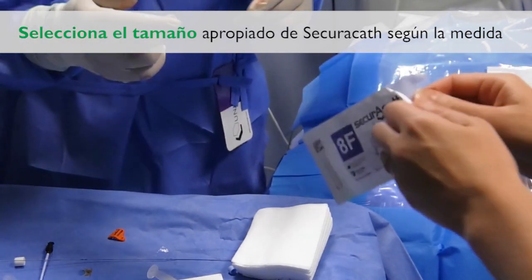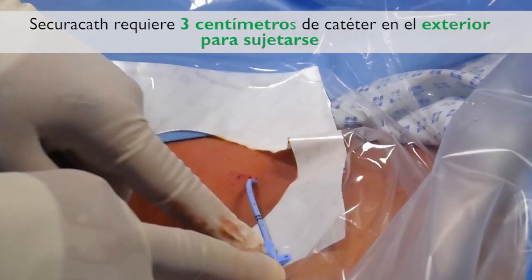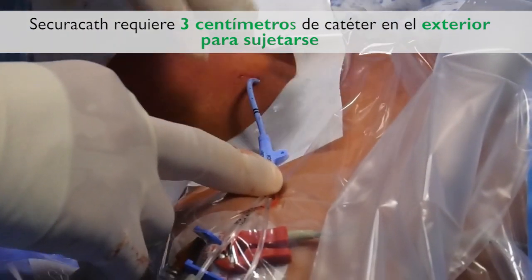Select the appropriate French size SecuraCath to match the catheter diameter. The SecuraCath requires 3 cm of external catheter shaft to attach to.